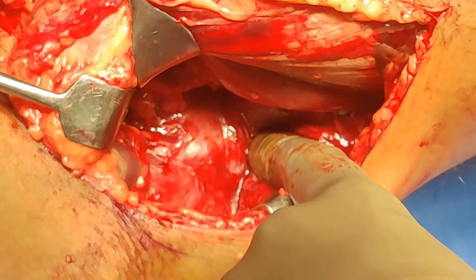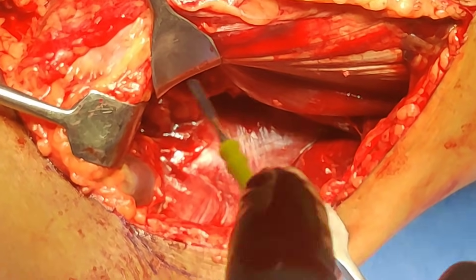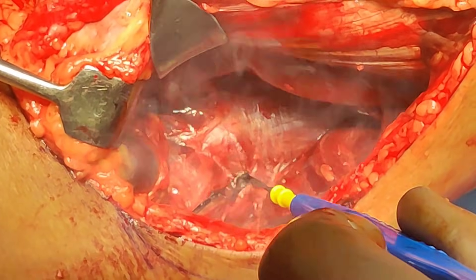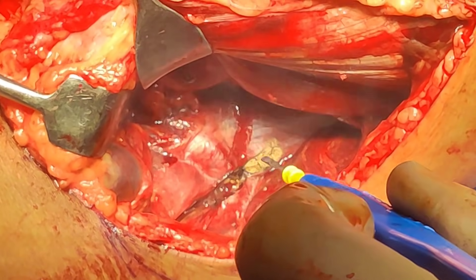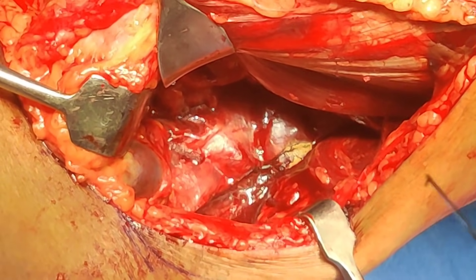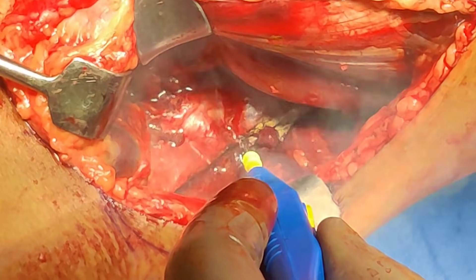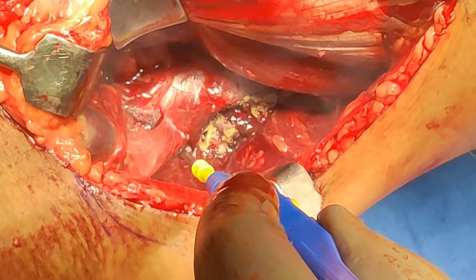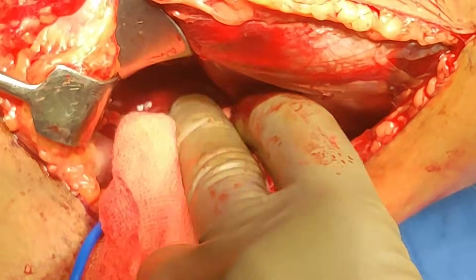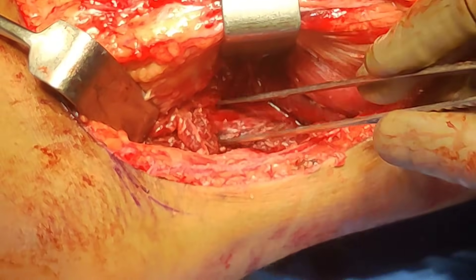The next thing is to feel the posterior medial border. You can use either diathermy or a knife to reflect this. The key is to stay close to the bone once you have identified the posterior medial border. I am right onto the bone now. There was a lot of hematoma which we have washed. Now we have reflected the popliteus and soleus.